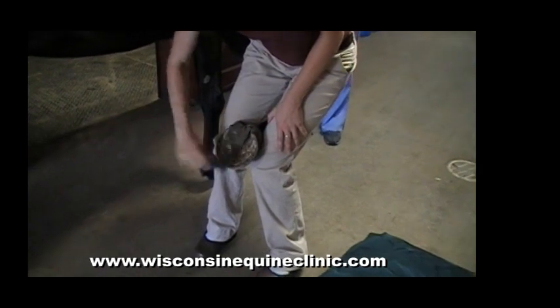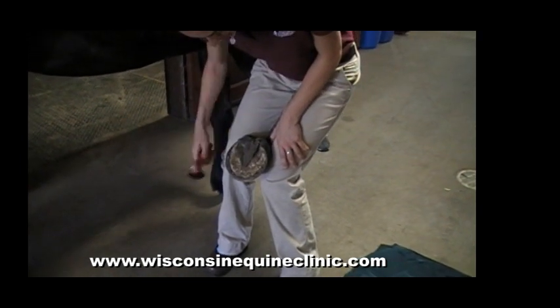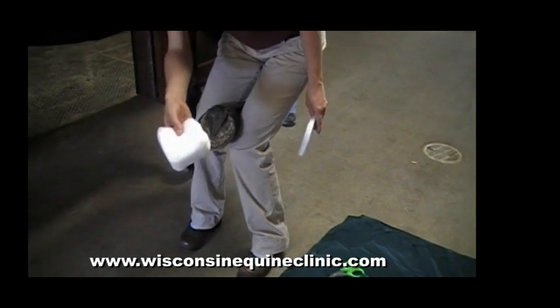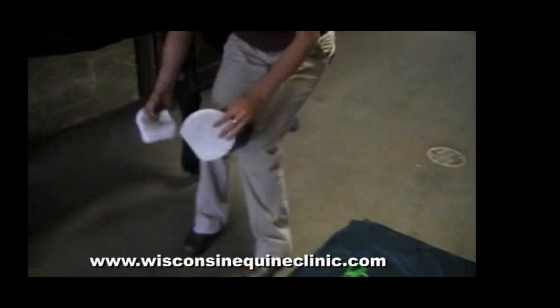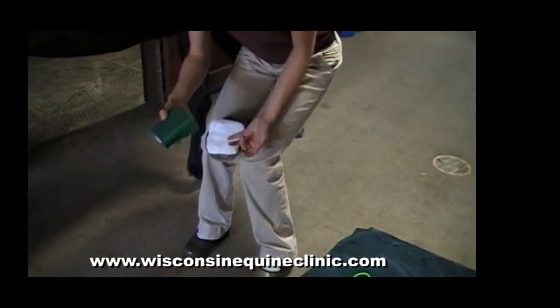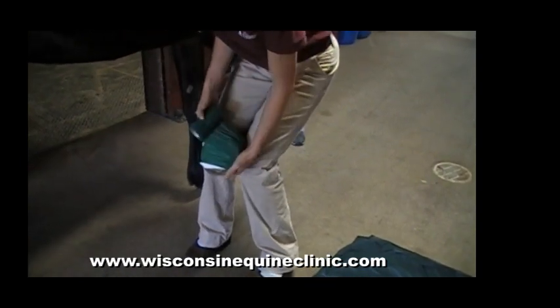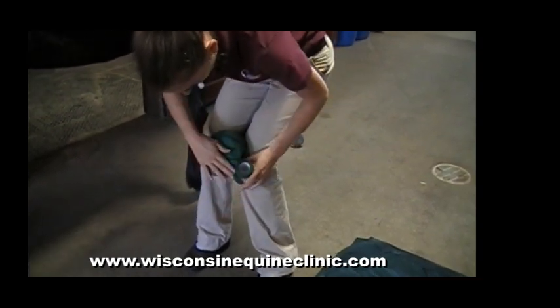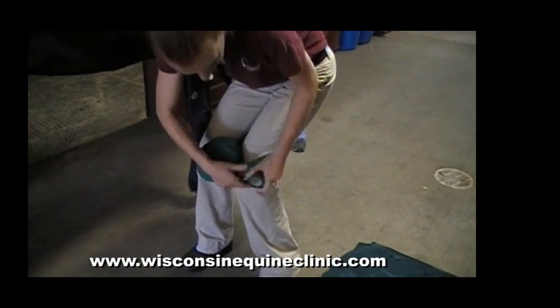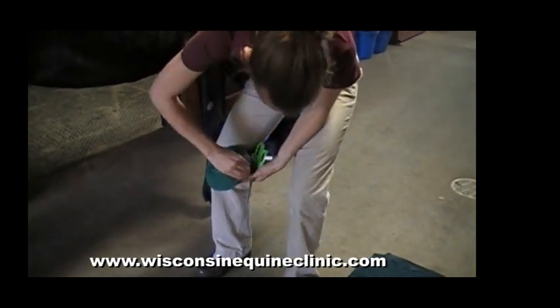First, clean out the hoof very thoroughly — no dirt, manure, or rocks stuck up inside around the frog. Then you're going to apply either medication to a 4x4, or just apply the 4x4s directly, or a poultice pad to the bottom of the hoof like this. We use vet wrap to secure the 4x4s in place, and we wrap around the hoof a couple of times. You can use your bandage scissors to cut the vet wrap, and it sticks to itself — just press hard on the side of the hoof.